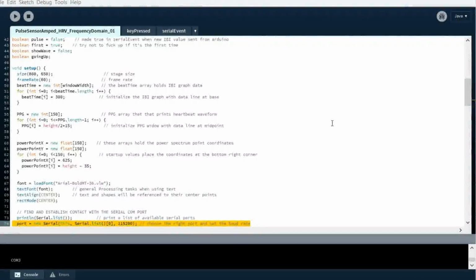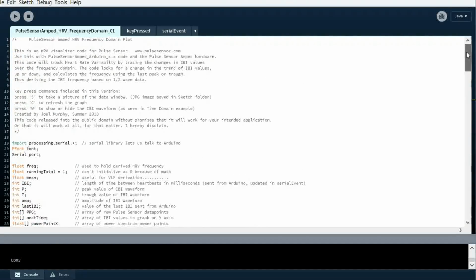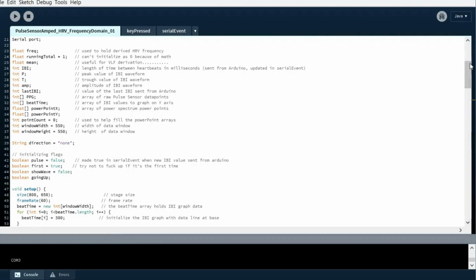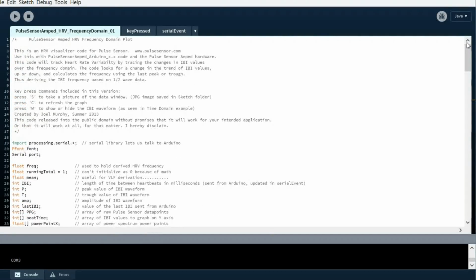Alright, just for reference, I want to show you some of the code that I used in my sketch to create the Hertz plot graph. This is from Pulse Sensor's website, or their GitHub site, and I'll probably post some links to that stuff in my Instructable. Anyways, it's the Pulse Sensor Amped HRV Frequency Domain application. And I really didn't change any of this. I just got it set up so that it would work with my Arduino, and basically just set up the COM port. So, anyways, it does work, and I'll show you that in a minute.